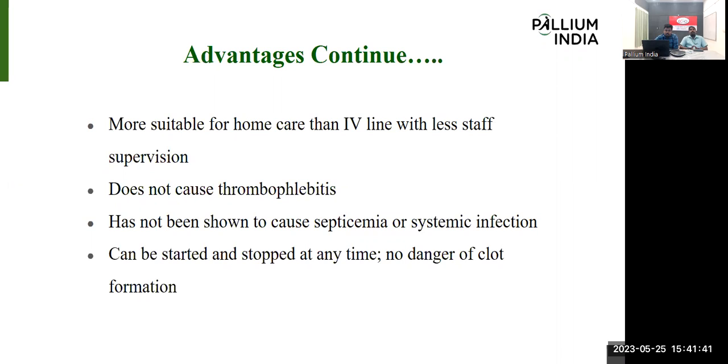But here, as I already told, there is no involvement of the circulatory system. There is no blood involvement with the subcutaneous space. So there is no clot formation. So at any time we can give, we can stop, and again we can restart. Today morning we give one bolus injection, and the next day or maybe 2 days later also we can restart, or give one bolus injection or infusion in the same subcutaneous space. If no complication happens, we can give in the same site.